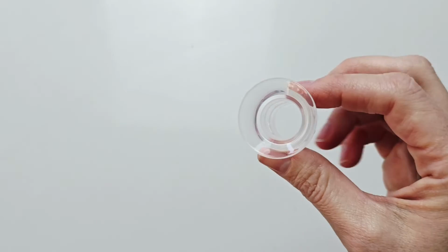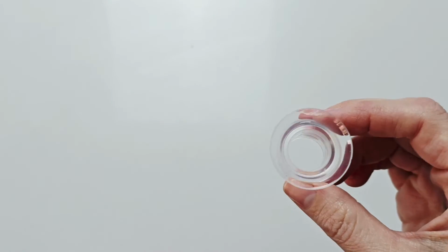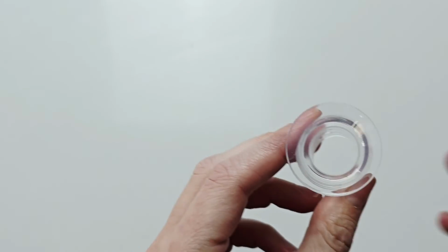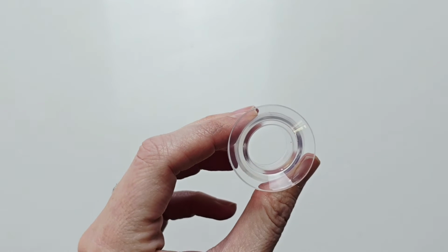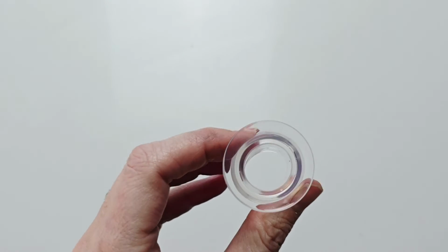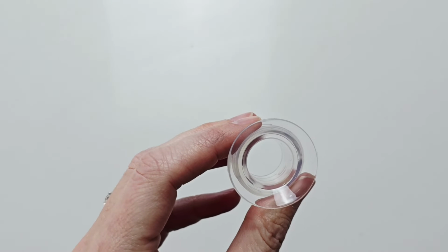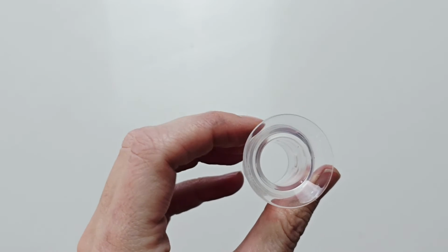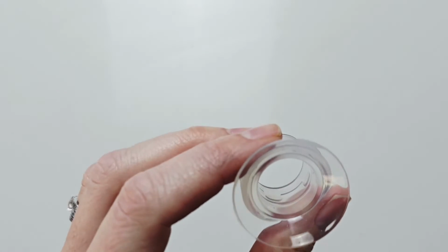And then you have your flange inserts. So these are the parts that sit in your flange tunnel to reduce the diameter. These have generally a good life to them. You can get around 6 to 9 months. You'll find though you will probably need to change your insert size before it wears out.